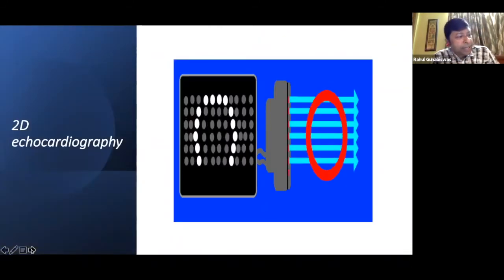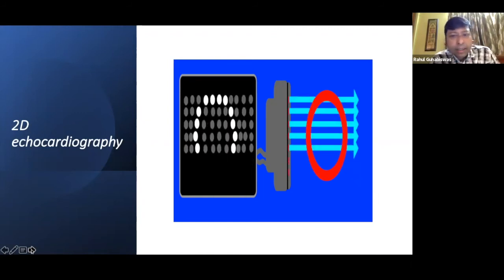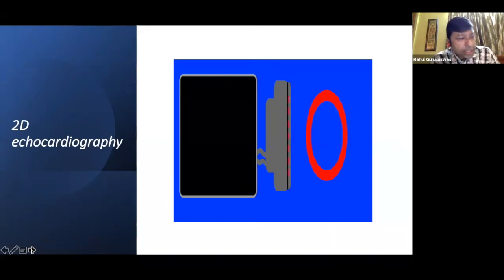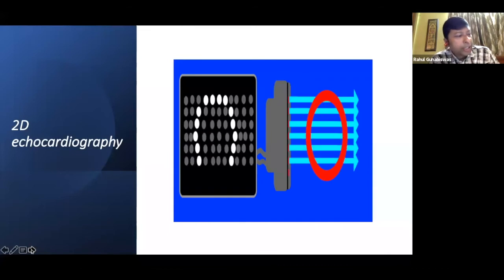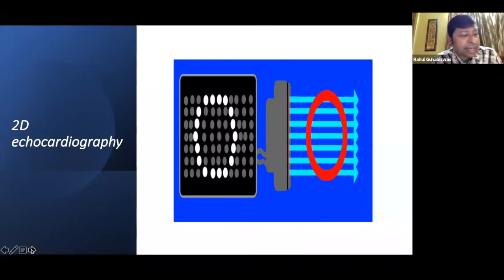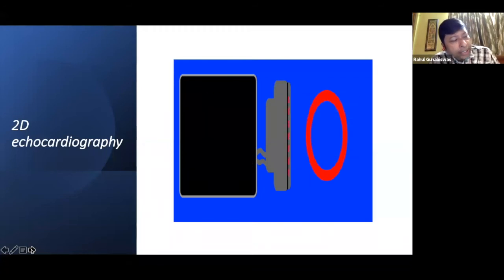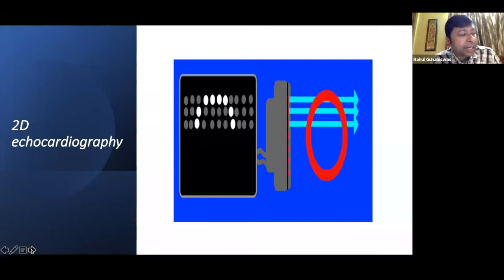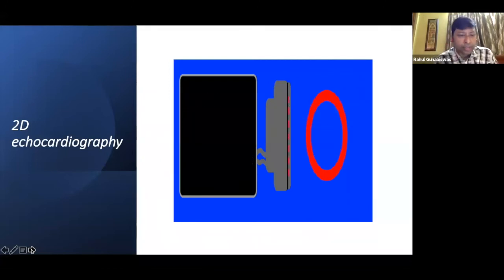The first such application is two-dimensional echocardiography, also called B or brightness mode. Using this knob directs each reflected sound wave to be displayed on screen as a point. Brightness of these points depends on the received energy using a grayscale. The sector scanner in brightness mode electronically sweeps across a plane, creating a cross-sectional image of the field of interest.